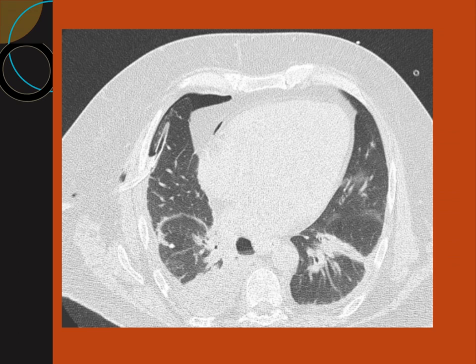did, because normally the guide wire is blunted and it is not causing any traumatic injury. Whether the underlying lung was more diseased, with bullae over there, or whether the introducer or dilators made a traumatic injury and it ended up in the lung. So be competent enough to do pleural procedures. If you're confident, then definitely it's the best way to proceed and to relieve your patient.